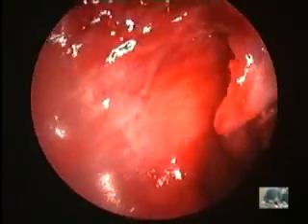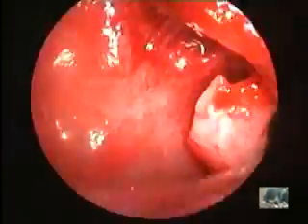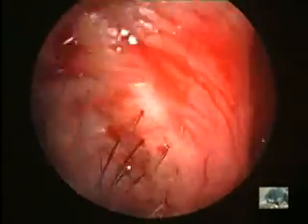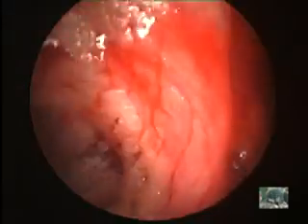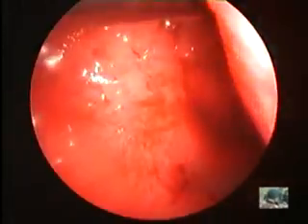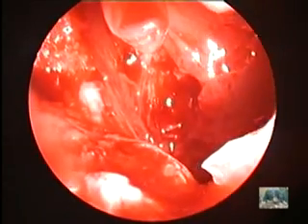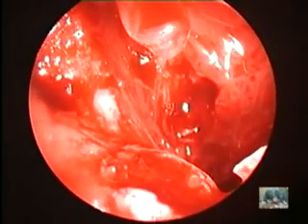Okay. Okay, it's out. Good. Now we can get a better view. Polypoid mucosa. Yes.